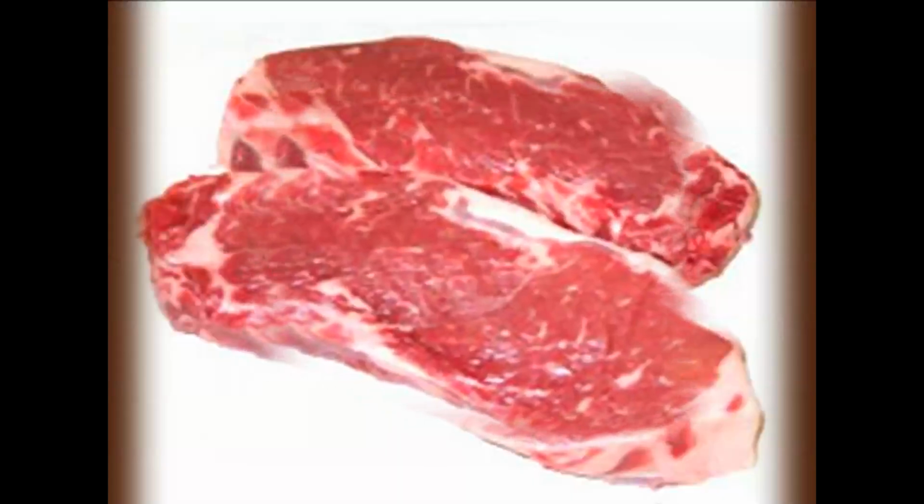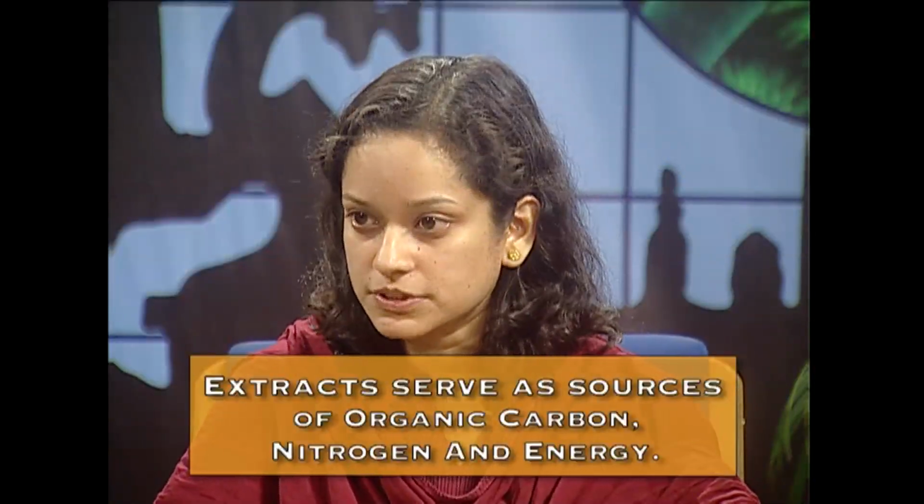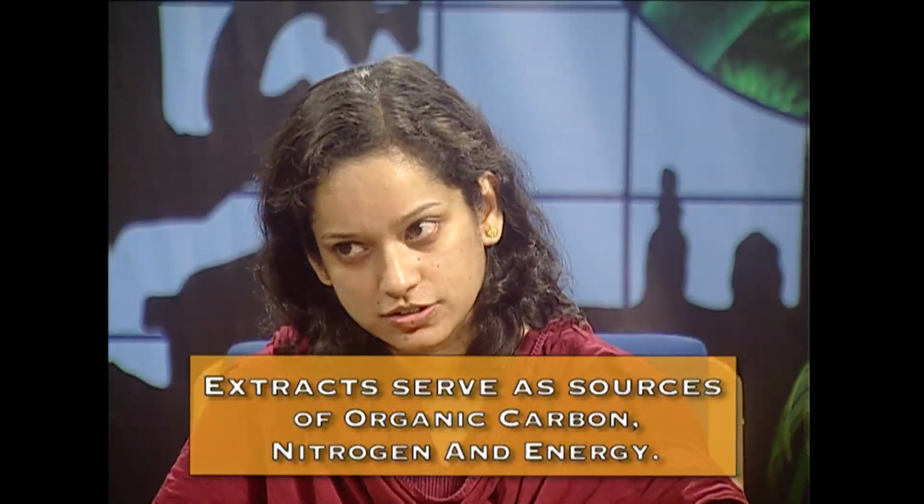Besides the major, minor, trace elements and vitamins, sometimes the media consist of other important additives. What are the important additives? Like it may contain extracts, which are derived from plant or animal tissues and serve as sources of organic carbon, nitrogen and energy.